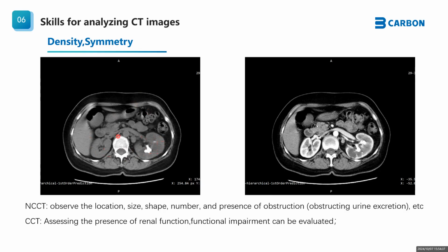non-contrast CT. But with contrast CT, we can see the enhancement of the renal cortex. Okay, this is the normal kidney. This is not normal. The cortex enhancement is not good. So the kidney is also damaged. The function is also damaged. Okay.